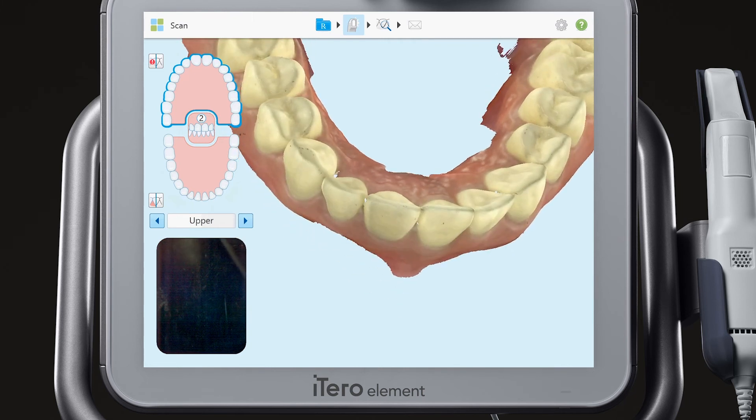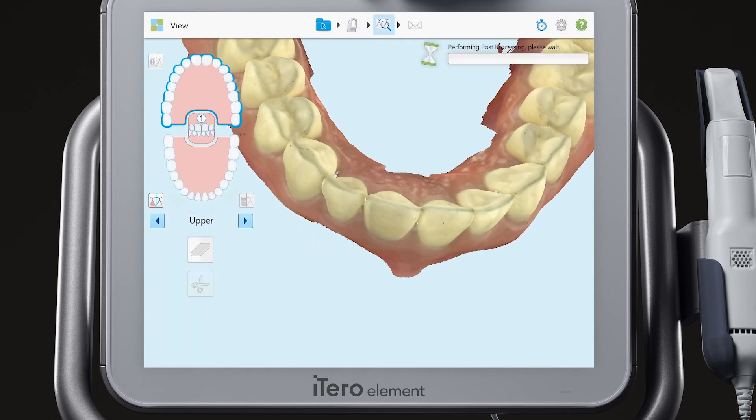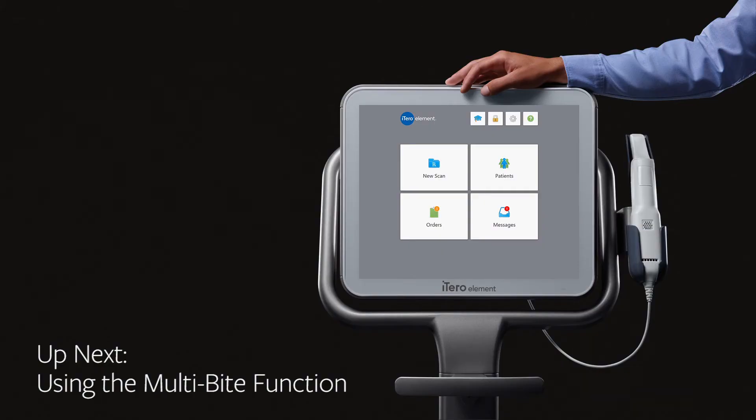Tap the view icon, review the processed model, and when you are ready, send the case.